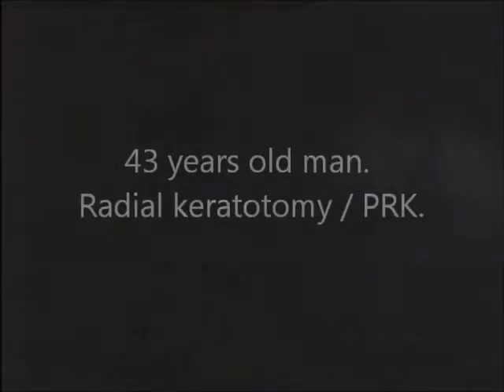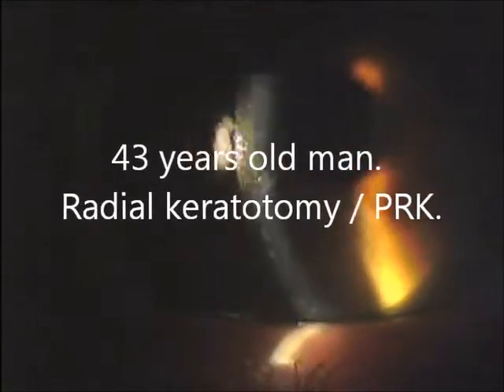In the following case, a semiscleral contact lens is adapted in a man with a previous radial keratotomy in the right eye and PRK in the left 20 years ago. We can see radial incisions and central haze in the fellow eye.